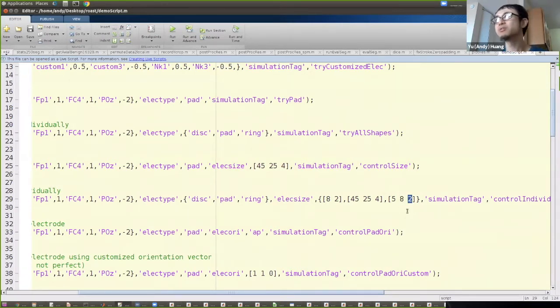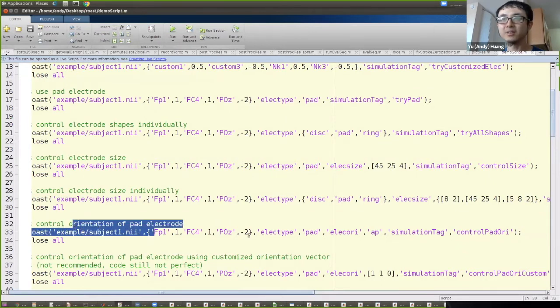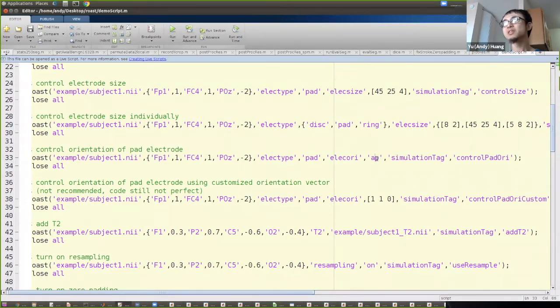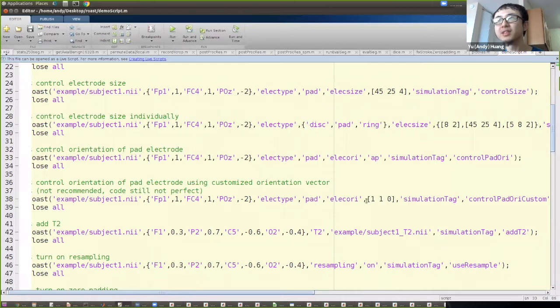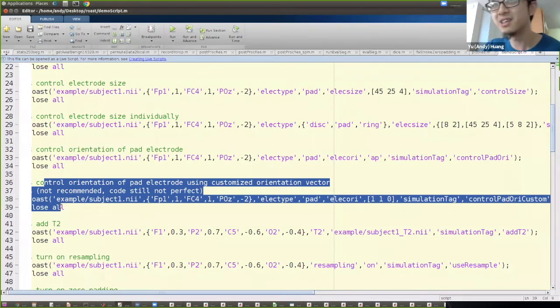You can also control the orientation of the pad electrode using the electric orient option. Options include LR (left-right), AP (anterior-posterior, meaning the pad goes from back to front), and SI (superior-inferior, meaning the electrode goes up and down). You can also provide an exact direction vector. Note: this feature is still a bit buggy and will be improved in the next release.